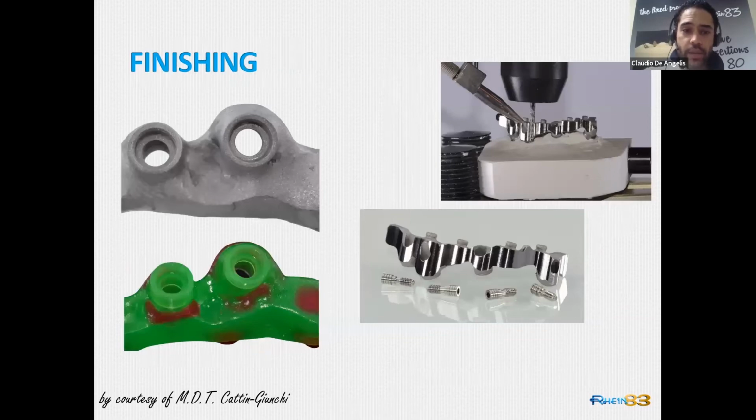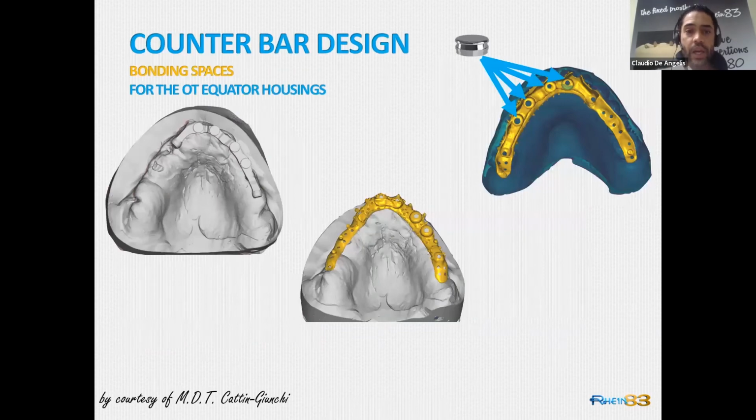So, okay, the cast bar, they go with the finishing, and you can see how they didn't touch the sphere here. Never polish, never touch the spheres with bars, just crystal beads at low pressure while you remove the bar from the investment material. Okay, back to the digital.